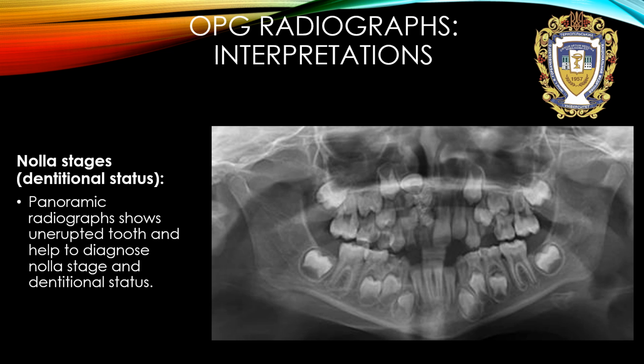Please notice, doctors, what pathology we can observe here. Horizontal position of tooth number 1-1.